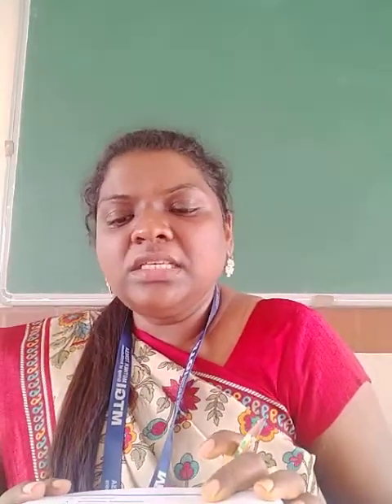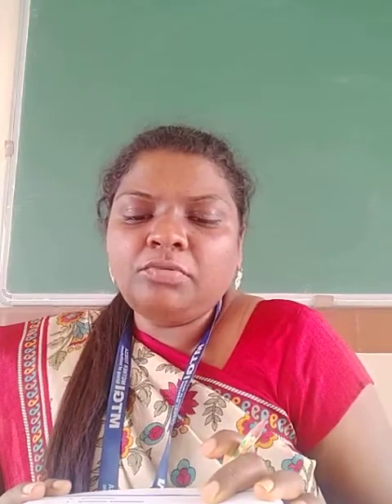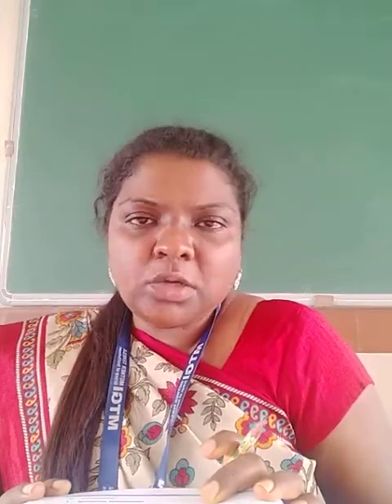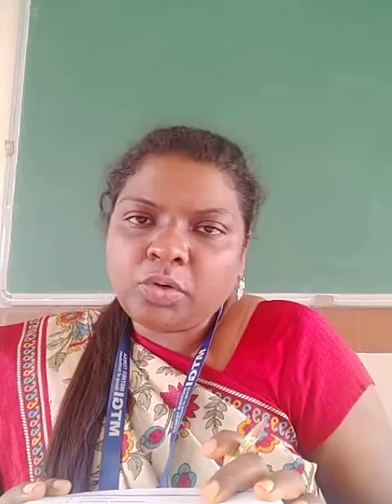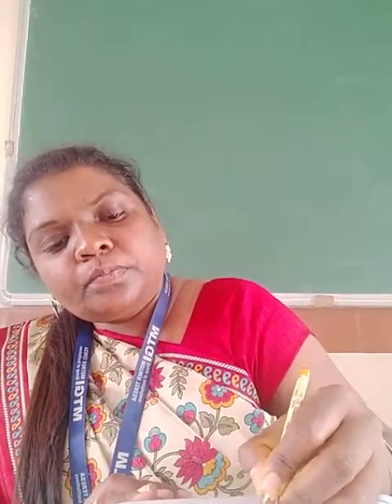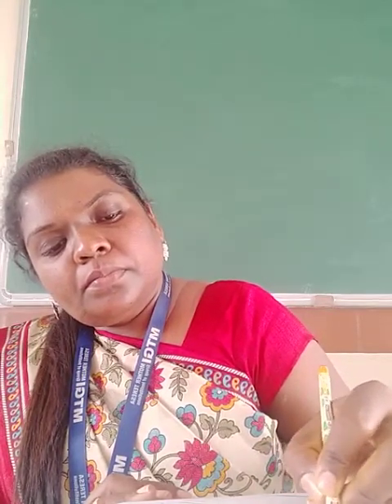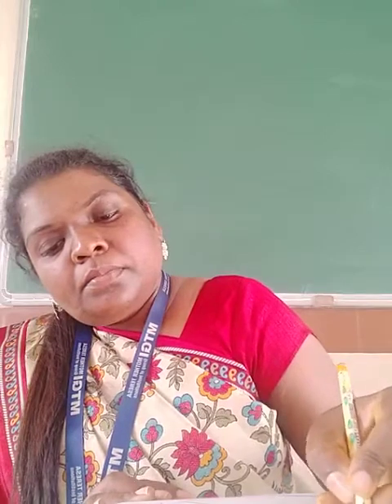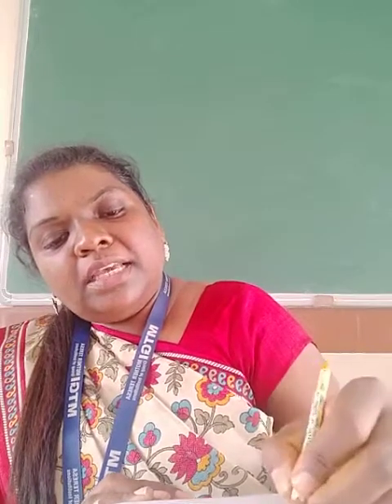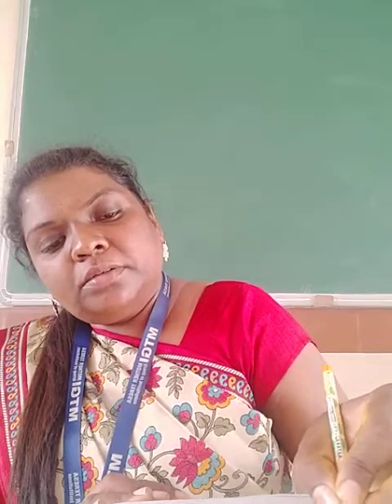Now after dialysis, check the patient weight, note any difference, assess for complication, check for signs of bleeding, status of the fistula, check out for urinary output. After dialysis, again vital signs checking also is very important, mainly with blood pressure.